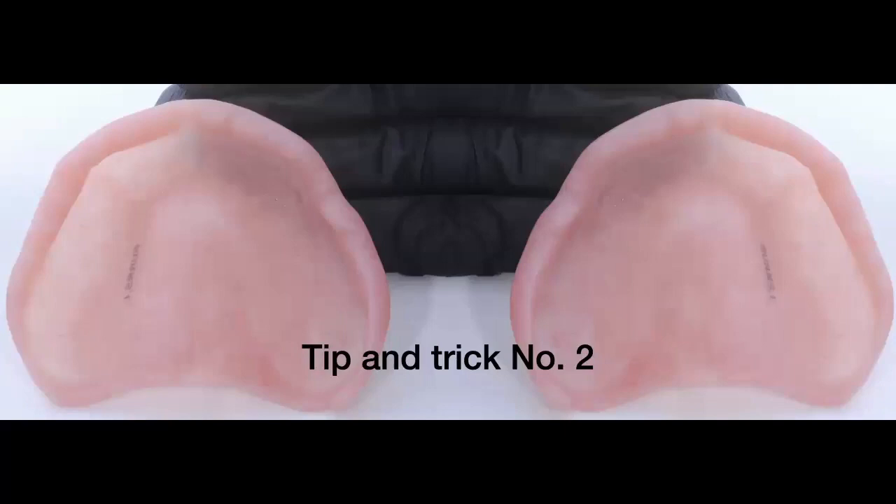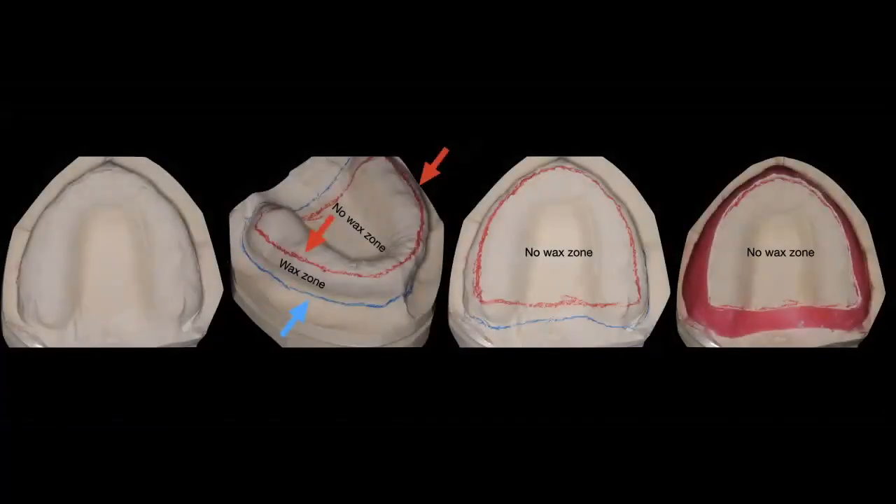This brings me to tip and trick number two. Now you've waited three to four months after extractions and the patient has been using their interim denture — it's time to make a final impression and fabricate your definitive denture. I want to share my impression technique because it makes an important point regarding impression materials and the construction of the denture base, which is crucial at the time of phonetics evaluation and wax try-in.